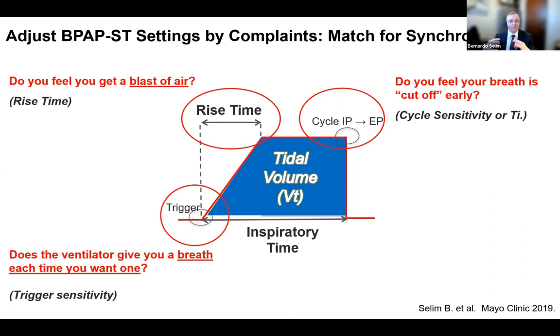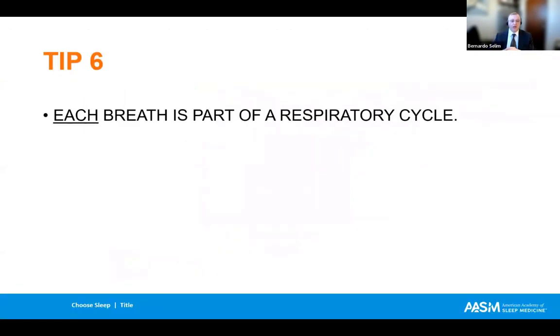Again, there's a mismatch in synchrony between your patient with an analog brain and your machine with a digital brain. You have to put them together to work together. All right, so we are quite advanced into our talk, and we're gonna go to tip number six. Each breath is part of a respiratory cycle.